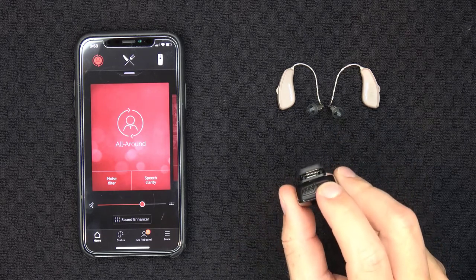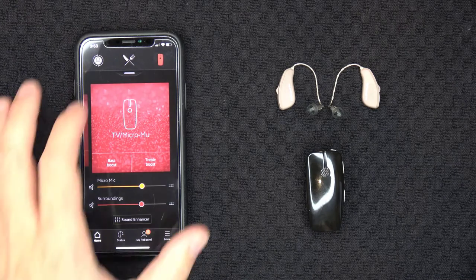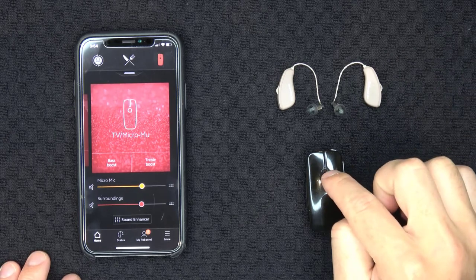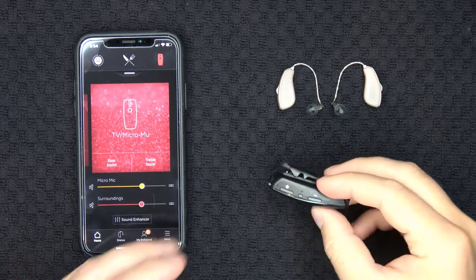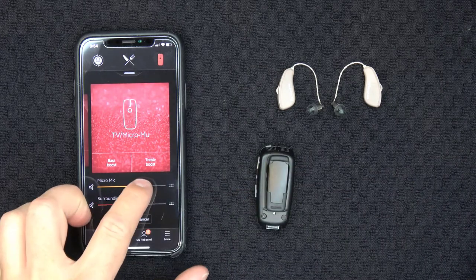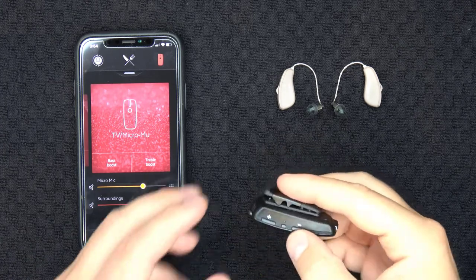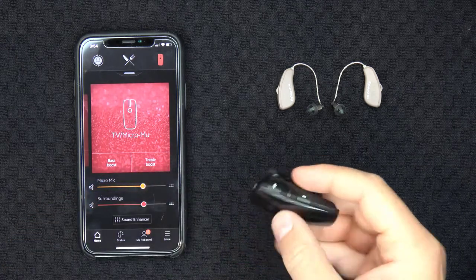To use the remote microphone feature on the Micromic, first turn the Micromic on. Then switch your hearing aids into the remote microphone/streamer program by either using the ReSound Smart 3D app or pressing and holding the multi-button for approximately two to three seconds on your hearing aid. Once in the Micromic program, you should start hearing the audio picked up from the Micromic's microphone being wirelessly streamed into your ears. You or your communication partner can use the plus or minus buttons to adjust the volume, or use the ReSound app to adjust the balance between your environment and the Micromic signal. You can also temporarily mute the audio from the Micromic by pressing the mute button, or use the app to do this as well.